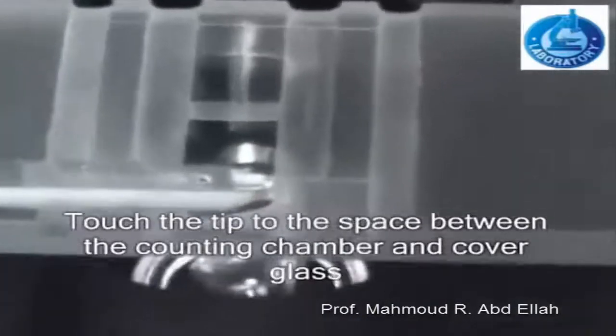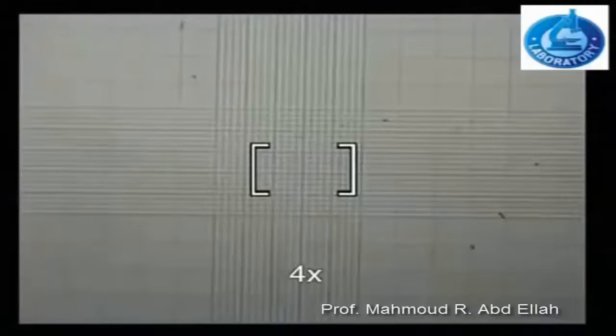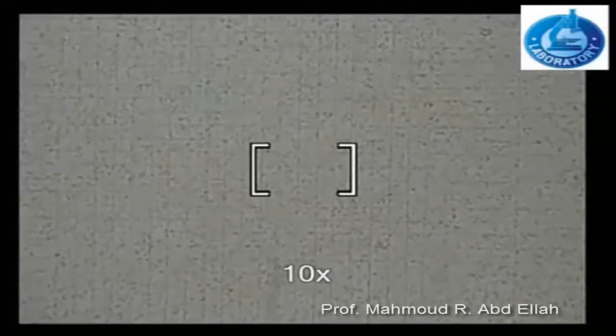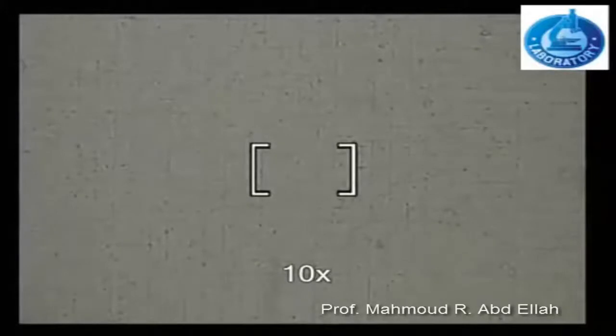Touch the tip of the pipette to the space between the counting chamber and the cover glass. Under the microscope at 4x magnification, the cells are very small and cannot be counted. At 10x magnification, it is also very difficult to count the red blood cells, as they are very small and cover the counting area.